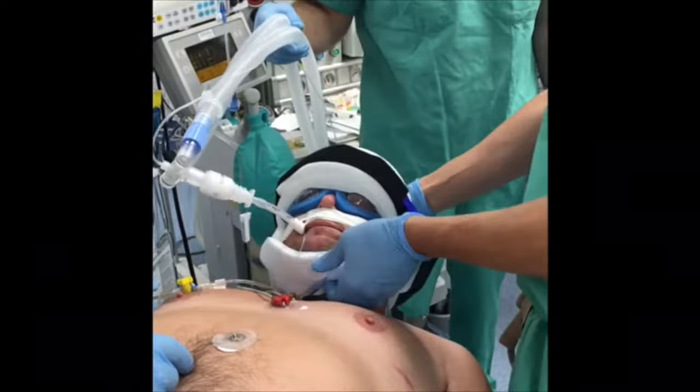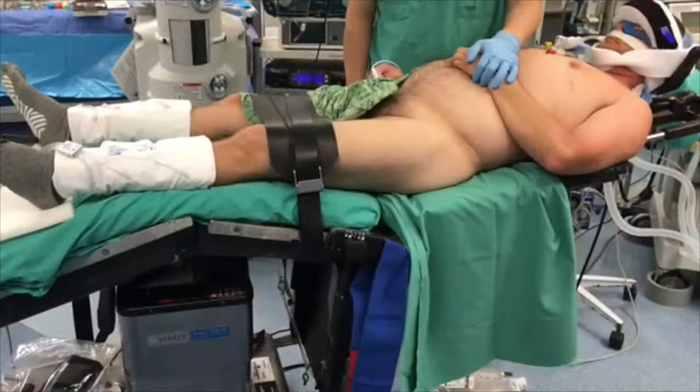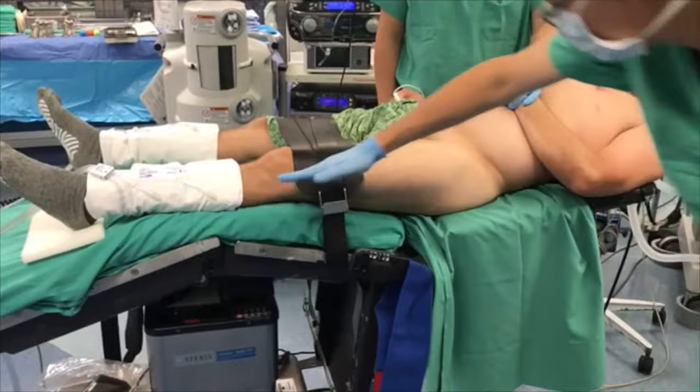A padded strap is then placed under the chin to prevent any intraoperative head movement in the sagittal plane. The table is then flexed at the knees and at the hips to prevent compression in the popliteal fossa and at the sciatic nerve.